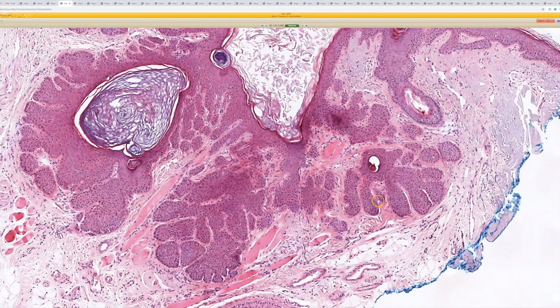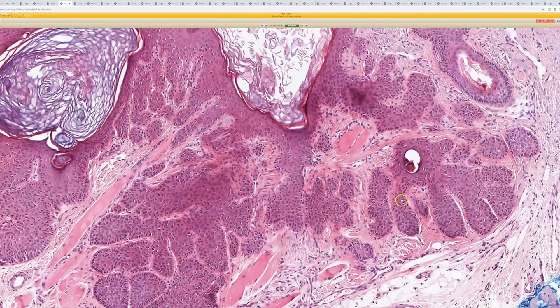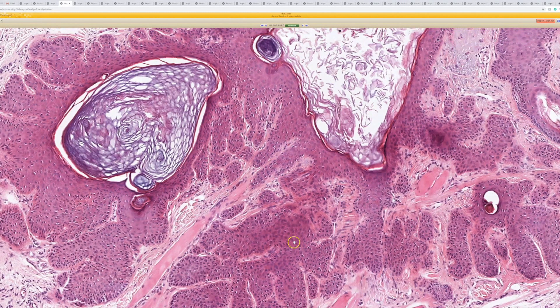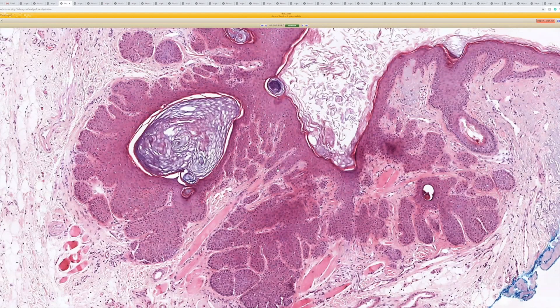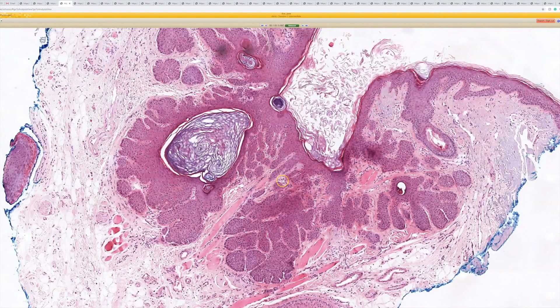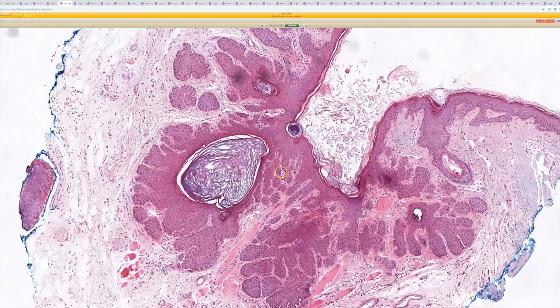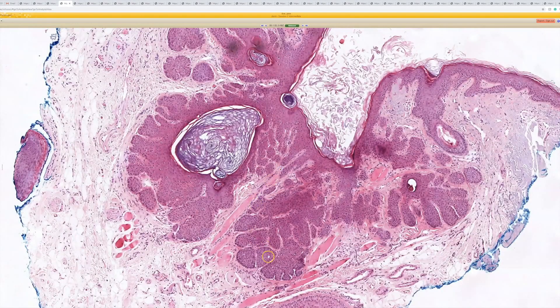This is a pretty nice example of what pilar sheath acanthoma is supposed to look like, but it's really one of those lesions on a spectrum with dilated pore of Winer. The cells are very bland keratinocytes and the rete ridges are expanded. My DermPath mentor in fellowship, Dr. Doug Parker at Emory, always said it was like someone took a bicycle pump and pumped up each of the rete ridges — they inflated and bulged out from the dilated pore. I thought that was a fun way to think about what a pilar sheath acanthoma can look like.